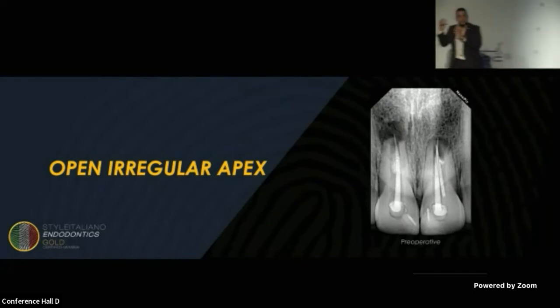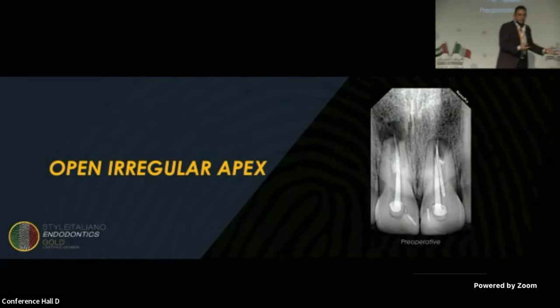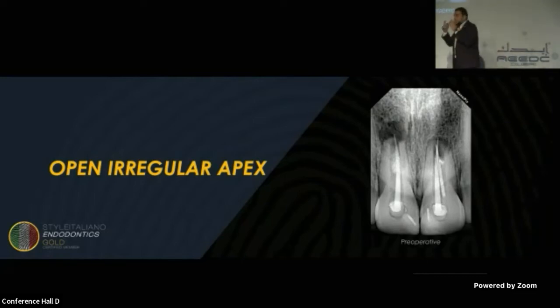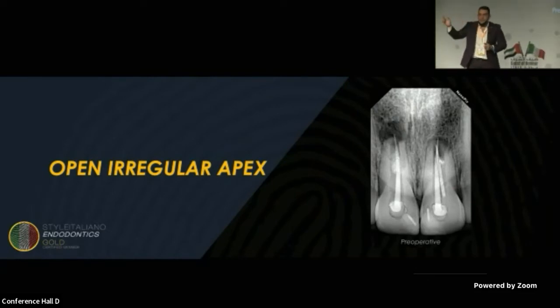I can't understand this type of obturation. I think the dentist missed the main goal of our treatment. It's not about putting Gutta-percha only inside the canal. We need to do cleaning and disinfection and a good seal after that. Actually, if you know the main goal of our treatment, your treatment will be very easy. Our focus during endodontic treatment should always be on the microorganisms. From the access cavity, we're trying to reach all the canals. Why? To reach all the microorganisms, right?